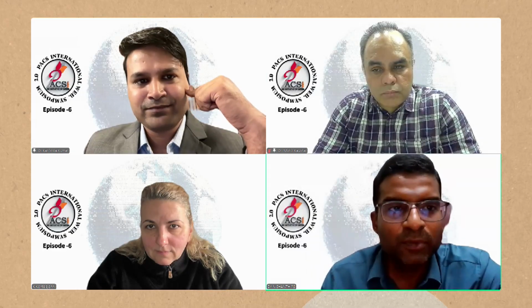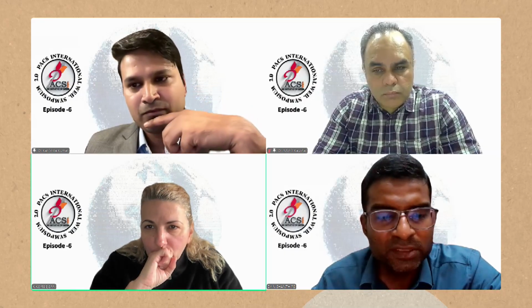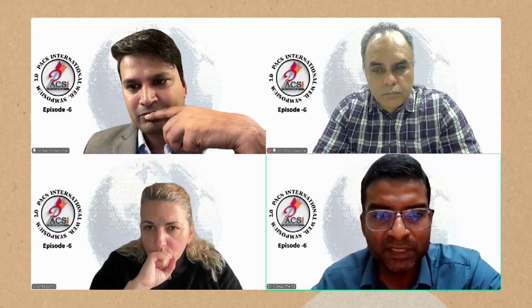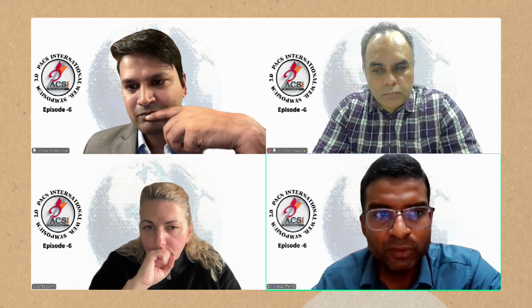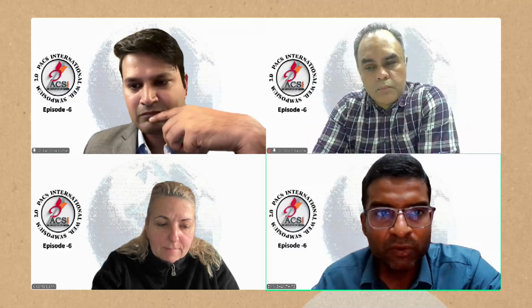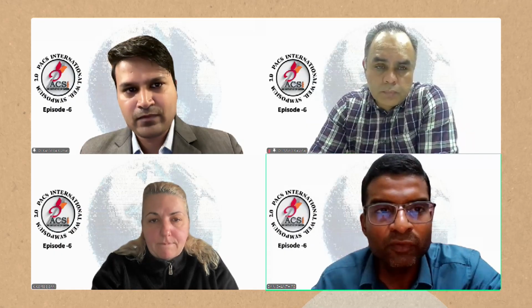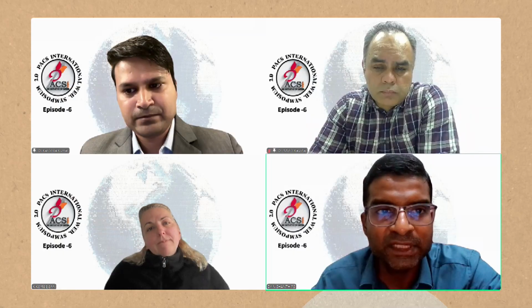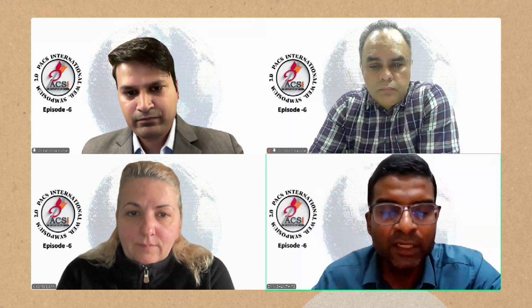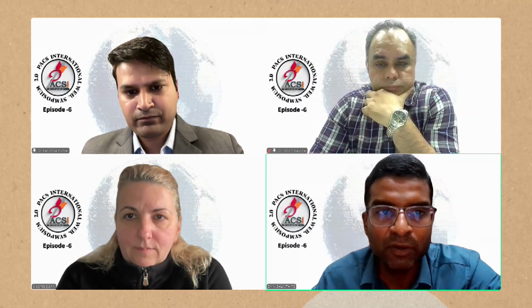It is about whether you are going to gain anything with the mini BAL, or whether you're dealing with an infective pathology. Because if you put saline in the airway, there is more chance of the patient going hypoxic. So if you really want to get an infective cause, then rule out tuberculosis, fungal etiology or any secondary bacterial infection, then the concept of mini BAL takes importance. Otherwise, in an emergency condition, going for a mini BAL will make the hypoxia worse, I think. Is it really needed? Is it adding any value to the procedure? You should have a clear picture before you genuinely want a mini BAL or not.